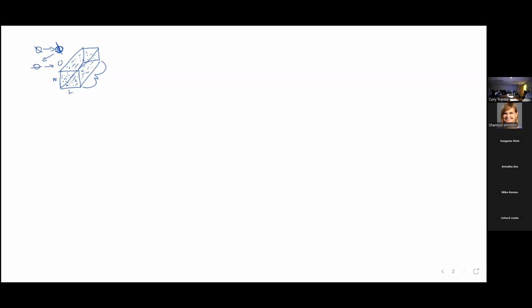We go back, we do this, remember? If there's lots of these guys in there, all of these little points, then we can get a lot of signal in the image. But the voxels are really big, and you don't get a lot of clarity for defining the target.